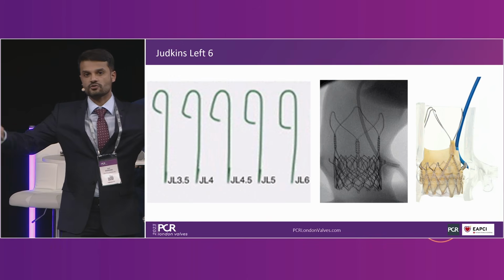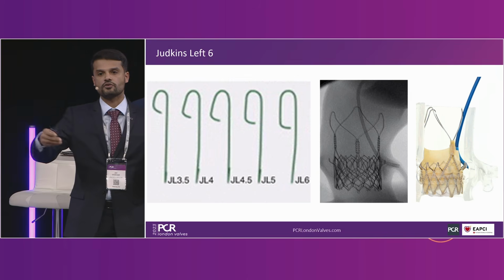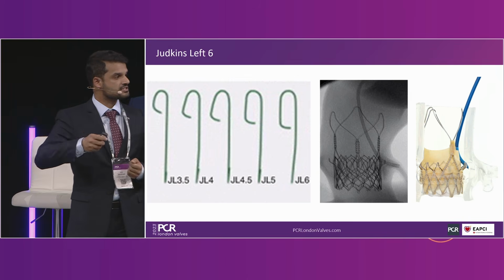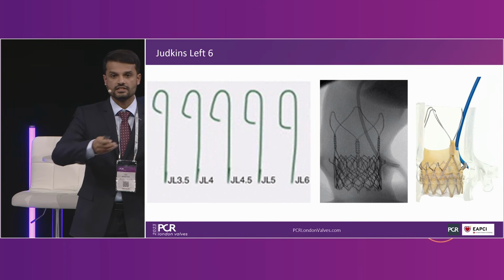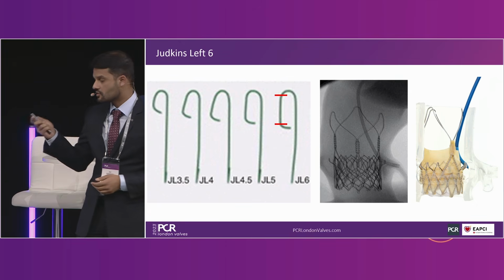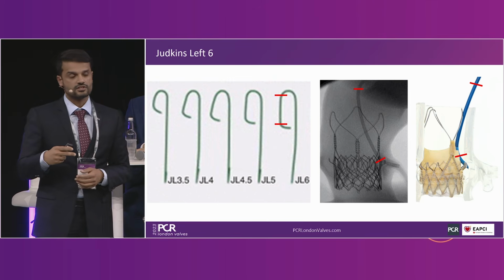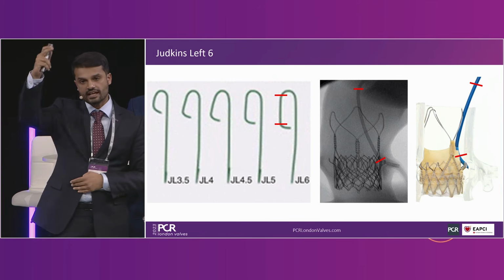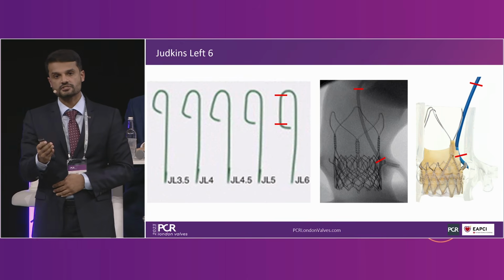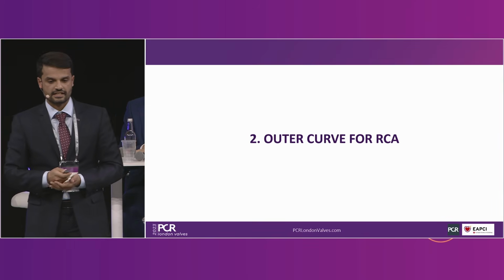Why JL6? So we know, conventionally, we upsize JL3, 4, 5, 6 as the aorta gets more dilated. You have a patient with an aortopathy on the table, the fellow knows, go with a 4 or 5 to begin with. And that's because of the difference between the primary and the secondary curve. The longer the distance, you use it for a wider aorta. Here it's different. To answer your question, we're using the difference between the primary and the secondary curve for the vertical sense, to allow you to simply drop the catheter in a very vertical way, avoid the central obstacles, and it allows you to come along the inner curve. So that's the JL6 or the inner curve technique.